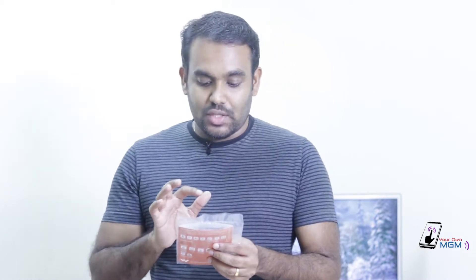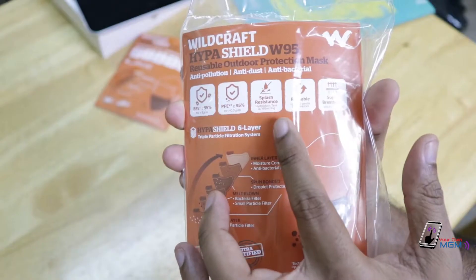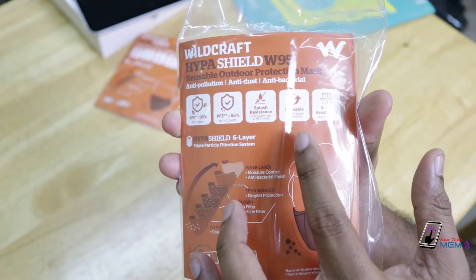Bacterial filtration efficiency is 95%. Particle filtration efficiency is 95%. It's splash resistant and reusable.